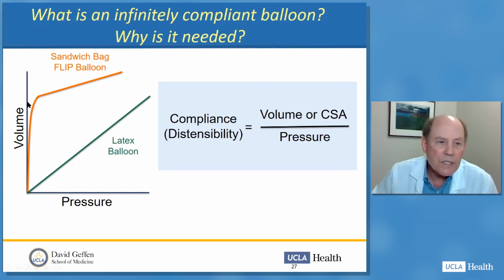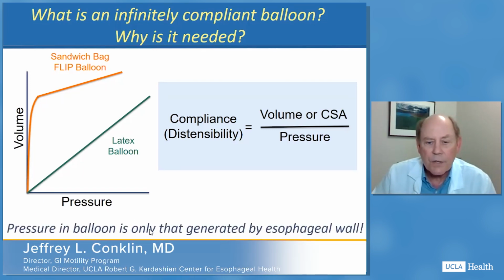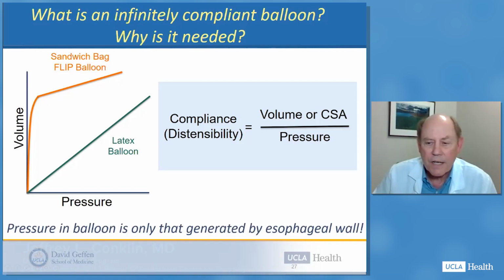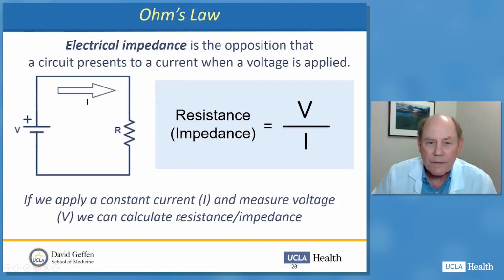The advantage of this balloon is if we continue to operate in the lower volume range here, any pressure that is measured in the balloon is from the biomechanical properties of the wall of the esophagus. That could be the elasticity, or it could be contraction. So pressure in the balloon is only that generated by the esophageal wall. Very important for this FLIP technology.